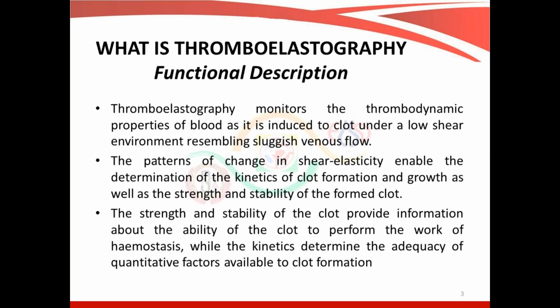So thromboelastography is measuring the thrombodynamic properties of blood as it is induced to form a clot under a low shear environment resembling a sluggish venous flow. The patterns of change in shear elasticity enable the determination of the kinetics of this clot formation and growth, as well as the strength and stability of the clot formed.